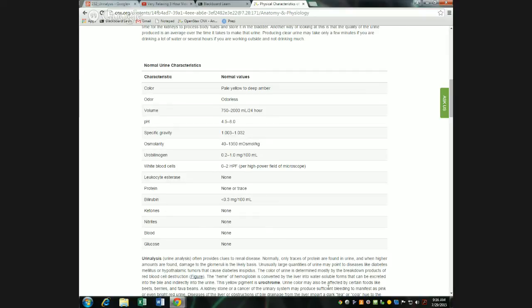All of the squares on here are represented in this chart on the bottle, and after you've done the reaction, you can hold the strip up next to the colored squares on the bottle and see what kind of reaction is taking place. For each square, slide it across and compare the colors until you find the color that matches closest.